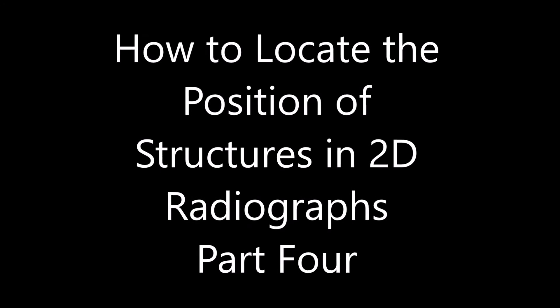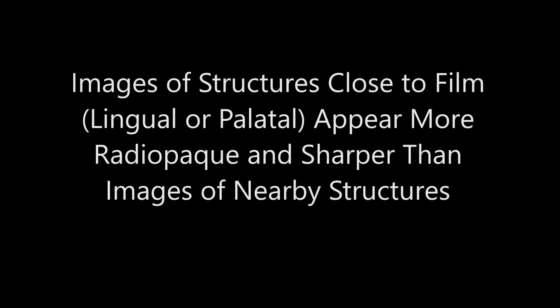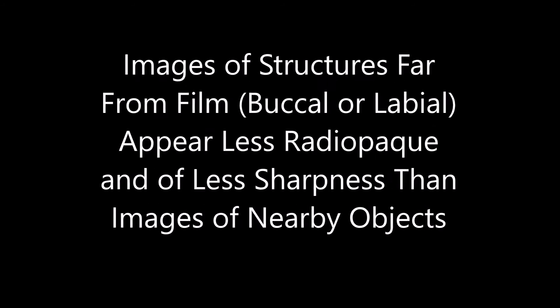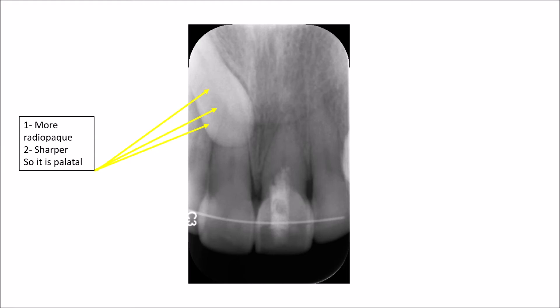Welcome to another video. In this video we are going to show two cases to help us in locating an impacted tooth — whether it is located in a buccal or in a palatal position in reference to the adjacent teeth. This radiograph shows a periapical radiograph of the central incisors and it shows an impacted canine. From this 2D radiograph, you cannot tell whether this impacted tooth is located in a palatal or buccal position, so that you can open your flap and do the surgery to take the tooth out.